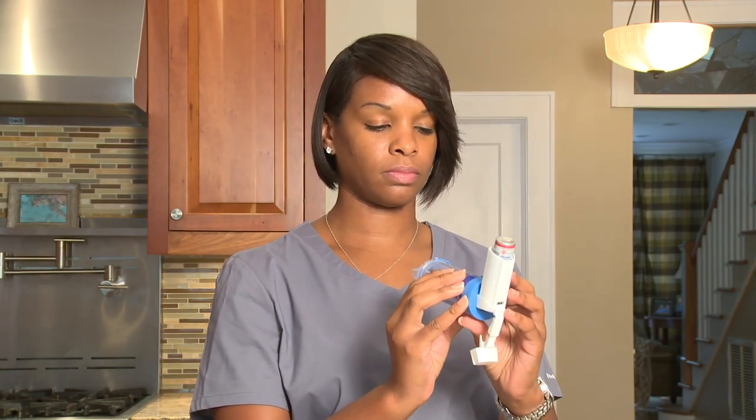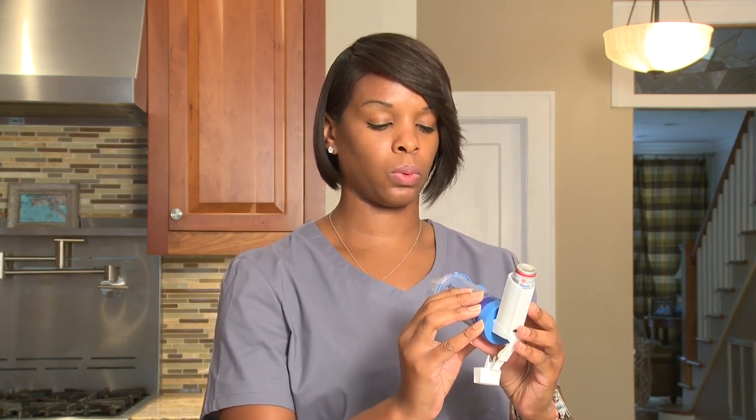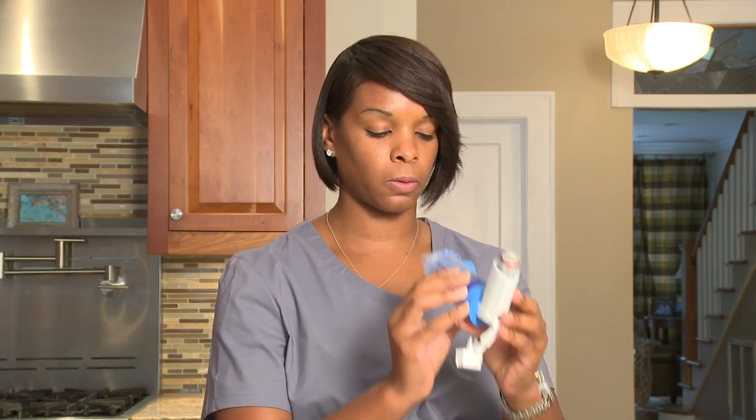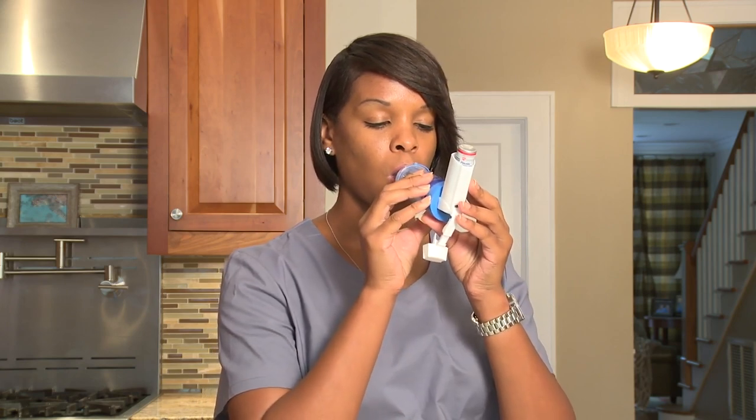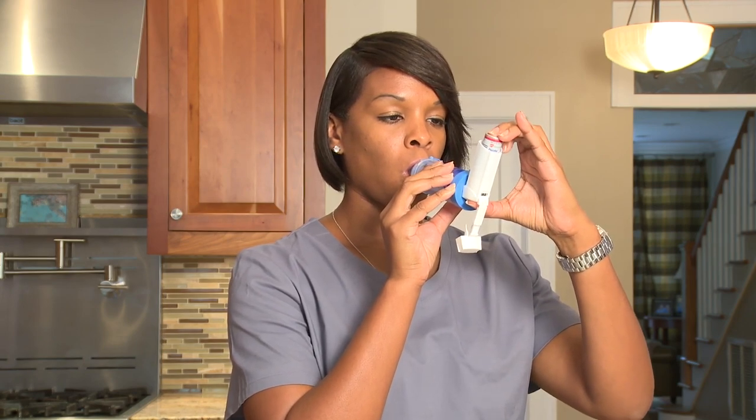MDIs should be used with a spacer. A spacer makes it easier for you to breathe in your medicine and also gets the most medicine into your lungs. This video will show you how to use your MDI with spacer and how to clean your spacer.